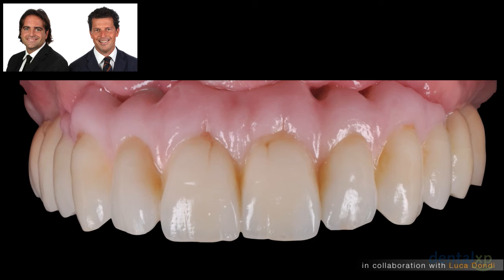All the aesthetic parameters are inside these pictures because he worked on the gingival symmetries, the dental proportion, the correct dental axis, the incisal embrasures, everything in its place, aesthetically speaking, but we saw also that functionally speaking, it has been checked carefully.